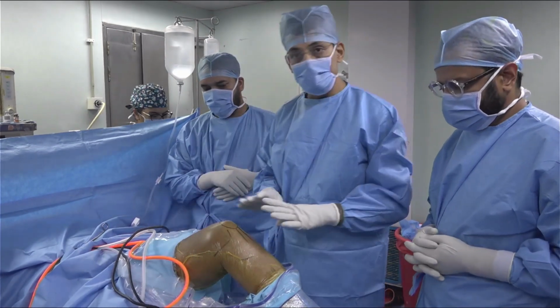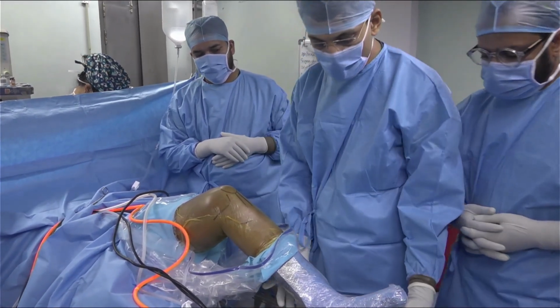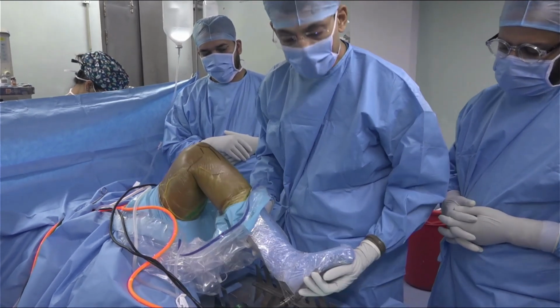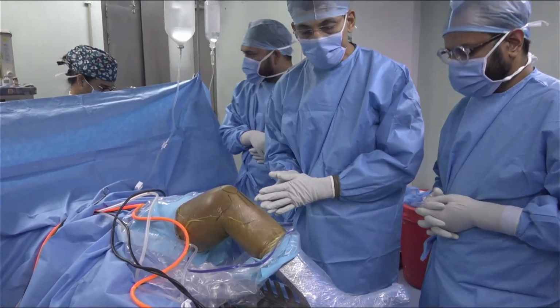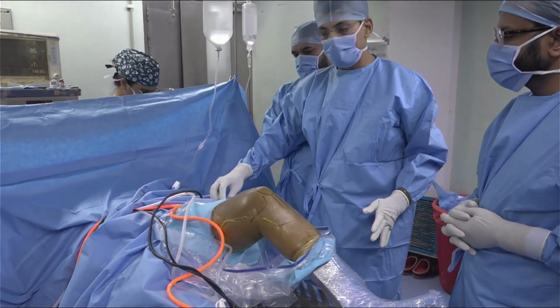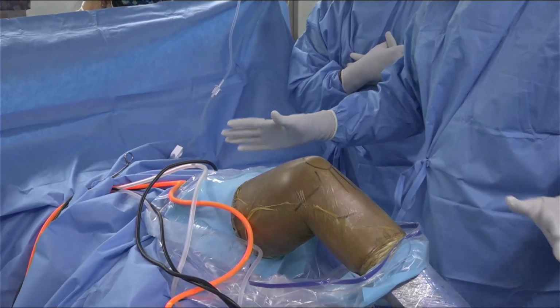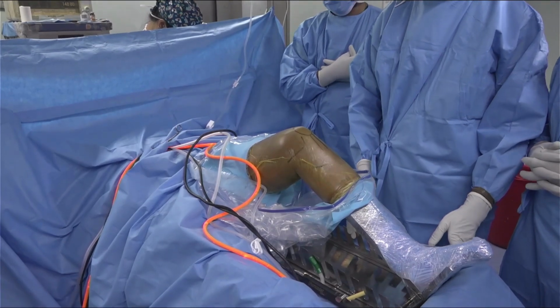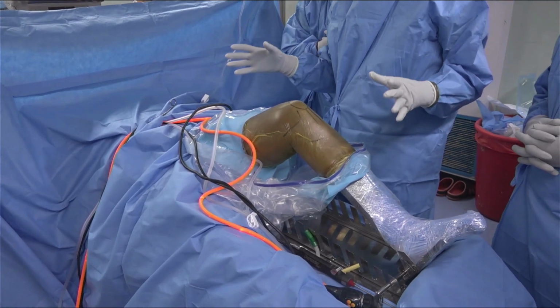We usually do it in a supine position, and we use this kind of a leg holder, which is very advantageous because we can change the flexion as per our wish in any patient. Whenever we want to drill the femur, we can increase the flexion. When we want to drill the tibia, we can decrease the flexion. We usually put a side support here to give thigh support, so the thigh does not fall back. So this is by and large a supine position with variable flexion angle options. This is our best setup that is required for an ACL surgery.